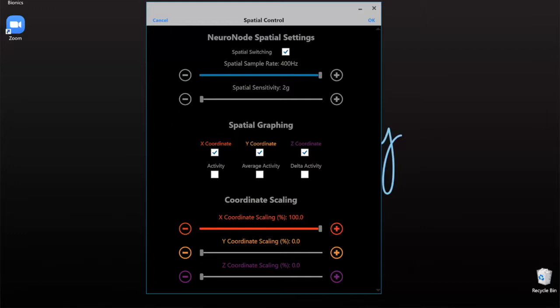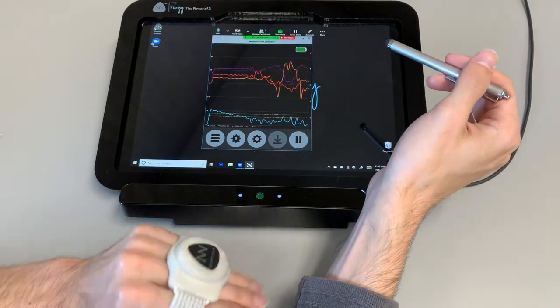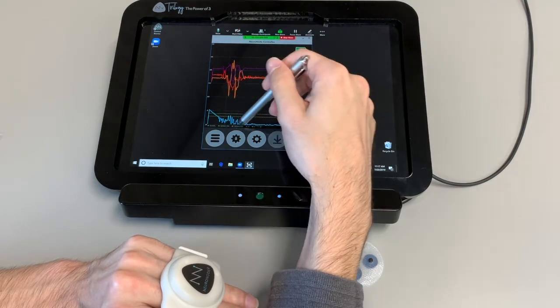Any coordinates that you are working with, make sure you do have them turned up to 100% so that you can track them. Whenever you know which one you need or how much of one you need, you can then turn down specific ones and set how much of one you want. Say we only want to track about 50% of the orange line and then we need to track all the movement of the red line — we can do that. Making sure that these are all the way up and these marked will let us see those motions. So from the graph, I can track different motions, see how that affects it, and choose which ones I want to have on so that it transfers down to our blue signal line.